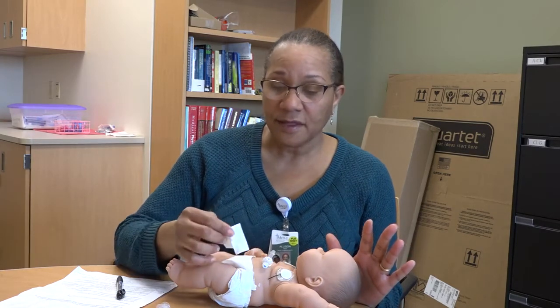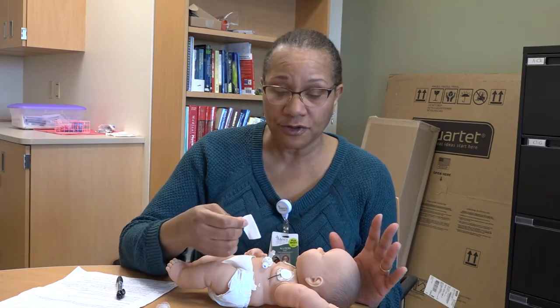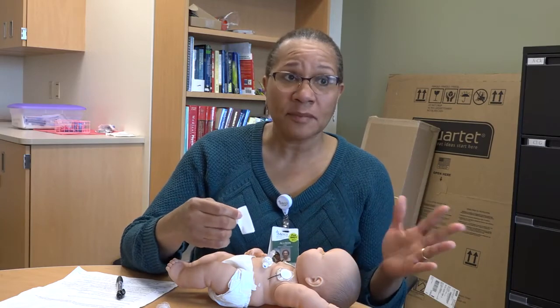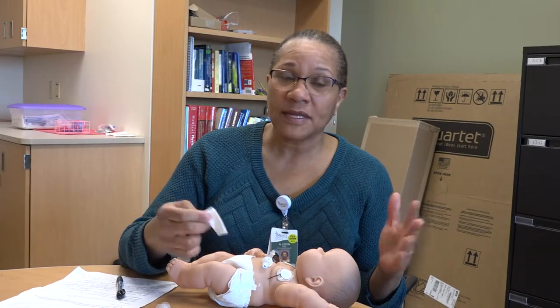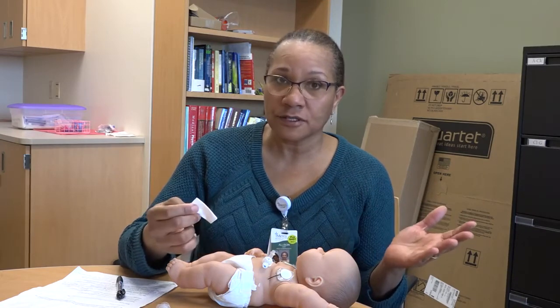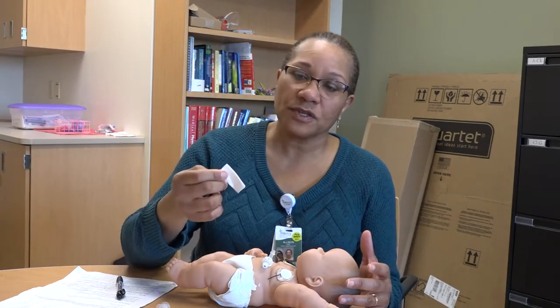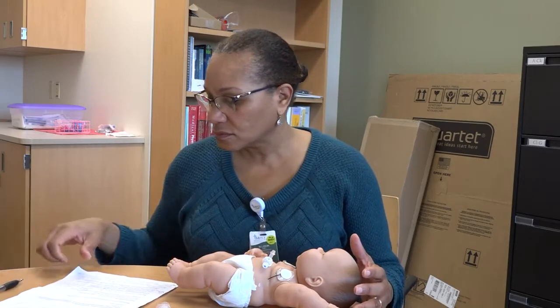Once you get to the point where the baby is not having any leakage and drainage from the G-tube site, then you do not need to continue to use the split 2x2s or any other dressing around the area. That will occur. It may not be within the first 3 months after surgery, but that time will come where you'll see very little drainage from the area. So when that time comes, then there's no reason to continue to use the split 2x2.